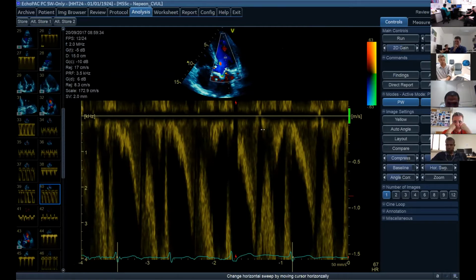I'm not entirely sure. No problem. Let's move on. So obstruction. Ramsey, are we looking at mid-ventricular obstruction? It's not exactly mid-ventricular, but it's just proximal to the left ventricular outflow tract, which could either be secondary to severe hypovolemia, or even because of hypertrophy, asymmetric hypertrophy of the septum. It's really nice, well done.